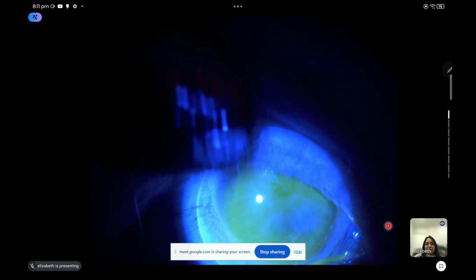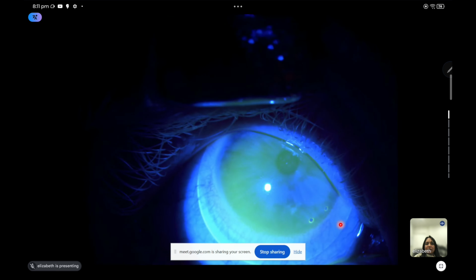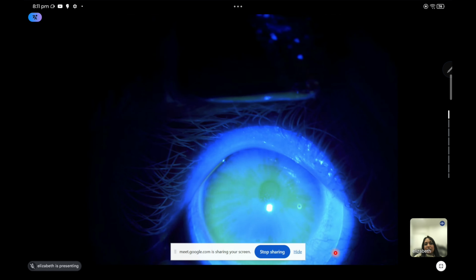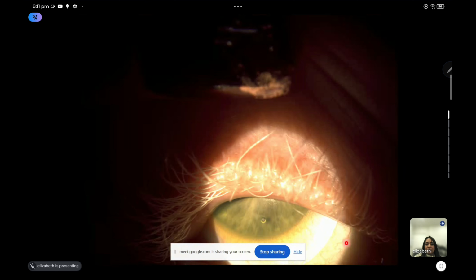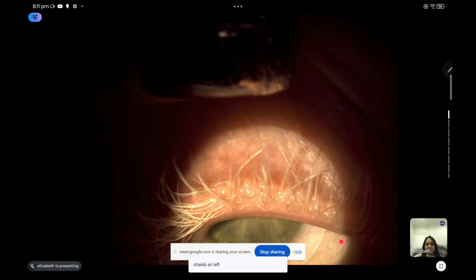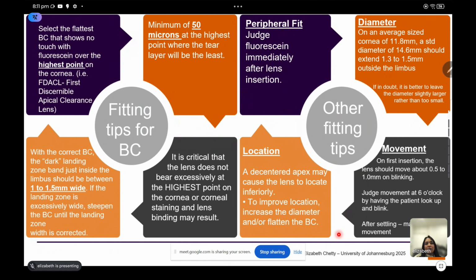All right, so I'm still busy with this patient refining the final lens. He's had it now for a month, we may still decide to change the edges if it hasn't settled yet, but we'll make those decisions at the aftercare visit. But for now, this lens brought this patient from being a low vision patient to a functional vision patient with the oblate lenses.